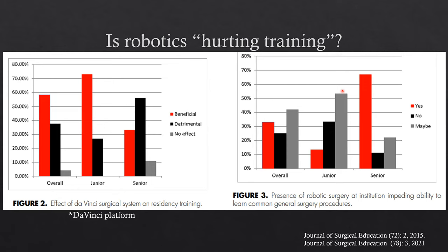And I think it can be as good as a teaching tool. For the longest time, when I was in residency, which is not that long ago, there was a lot of thought placed into these deformity cases, but not nearly to the point of what you can get through a robot, because you can calculate all those deformity angles very quickly versus doing it by hand and figuring it out. And usually the attendings just want to get through the case, so they don't really sit down and go over this stuff with you. You kind of have to learn it yourself.